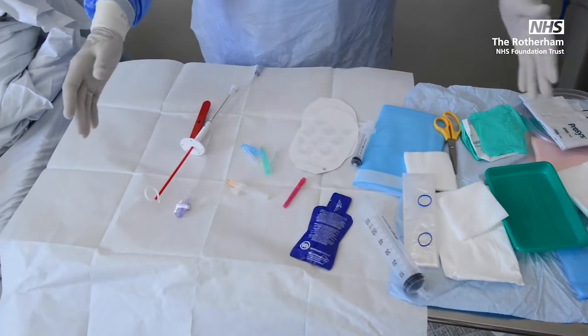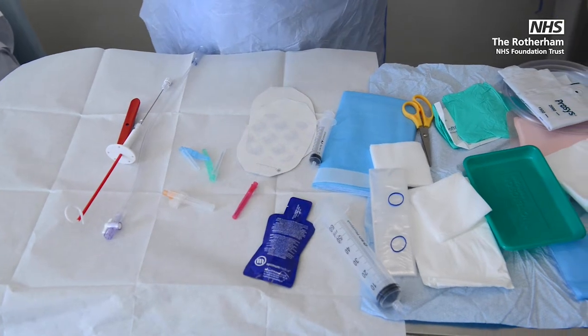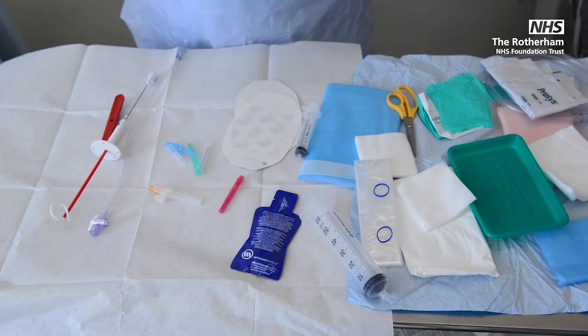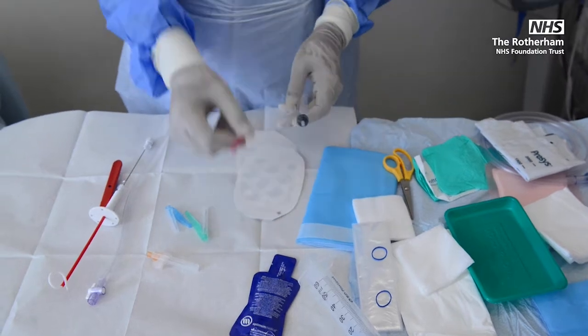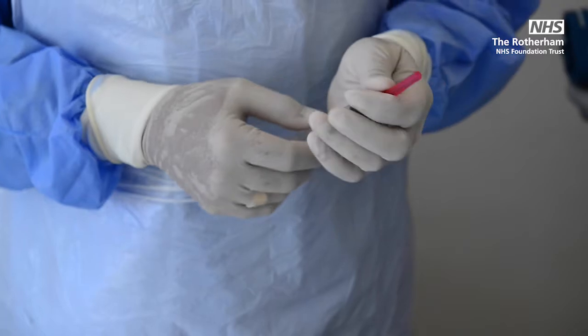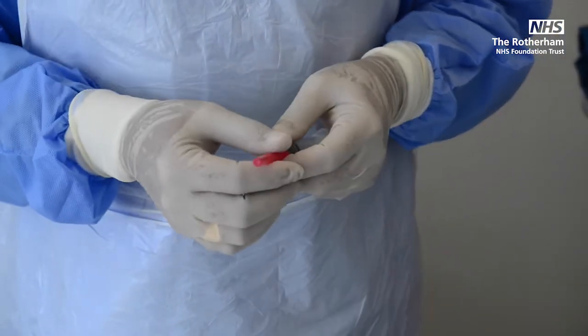We need a sterile field, which is here, and you need your sterile gloves, and make sure you have draped yourself as well. We need chlorhexidine swabs to clean the area, and then we need a 10 ml syringe and a blunt needle, that is to withdraw the lignocaine. That lignocaine is usually 10 ml, 1% or 2%, which we inject into the skin.